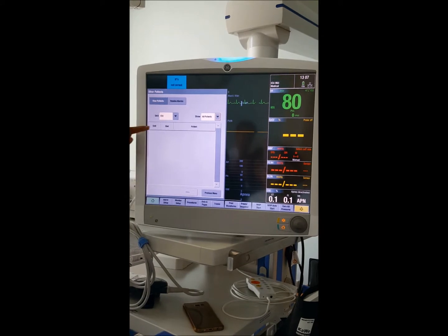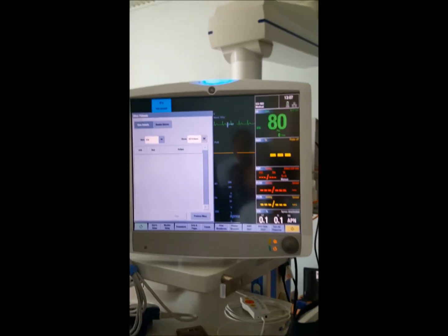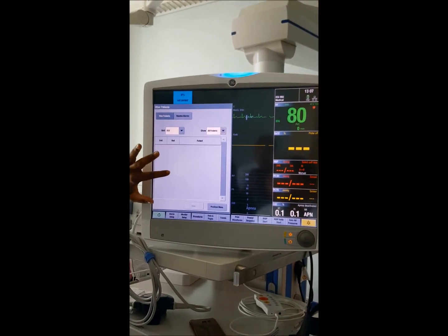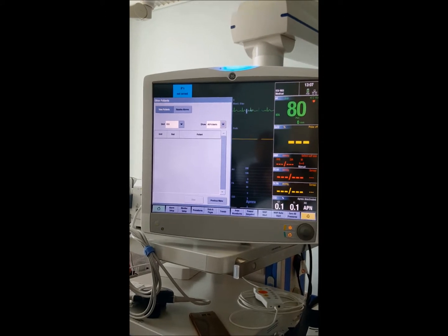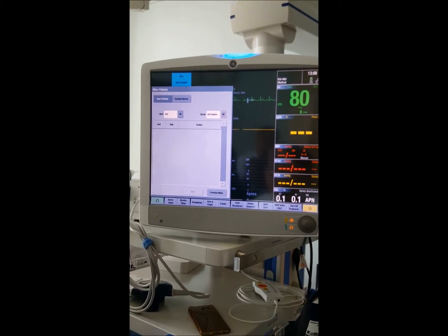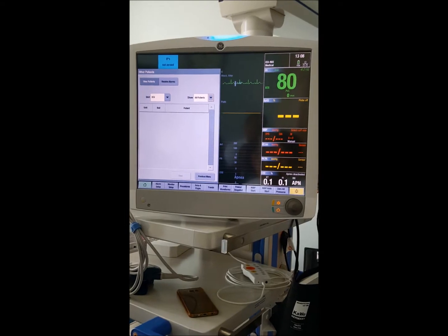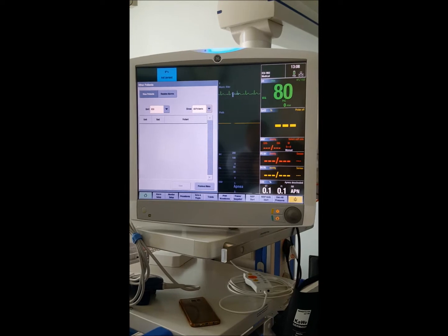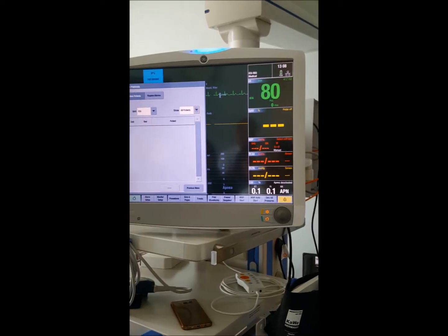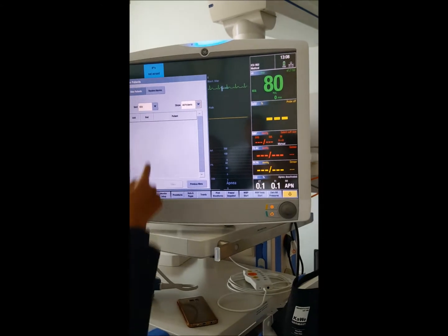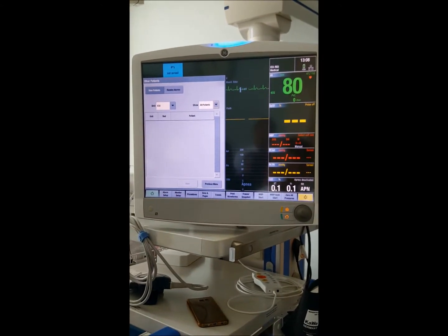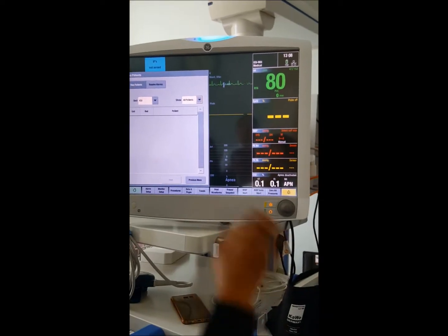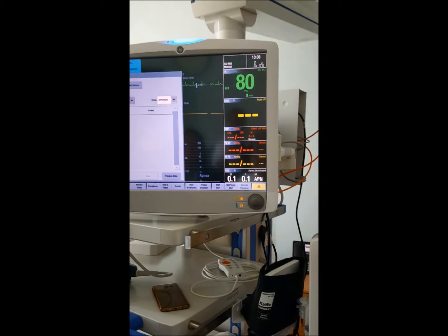When you press 'Other Patients,' a list of bed numbers appears — for example, all 16 ICU beds. Press bed number five and it will show the real-time screen of that bed. This is useful for nurses managing two beds at once, so they can monitor patients on screen without running around. You can view two patients at the same time: your current patient and one viewed patient.